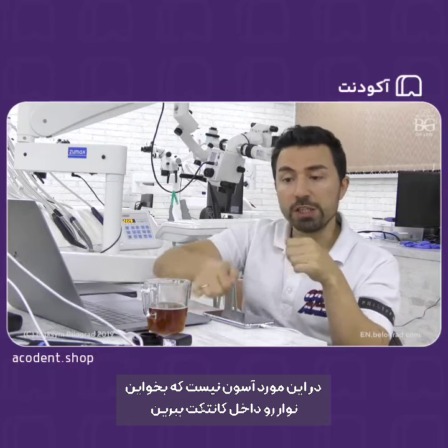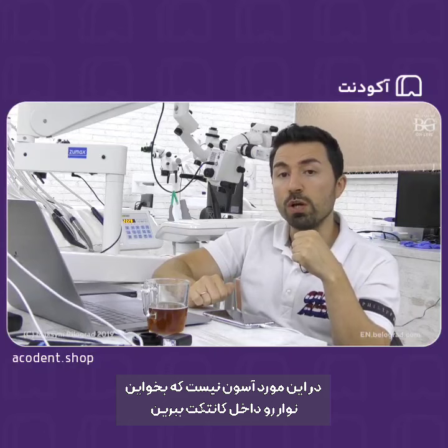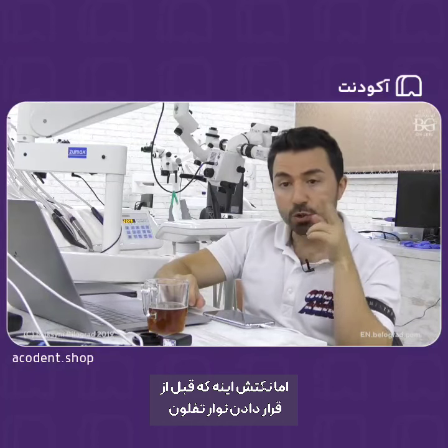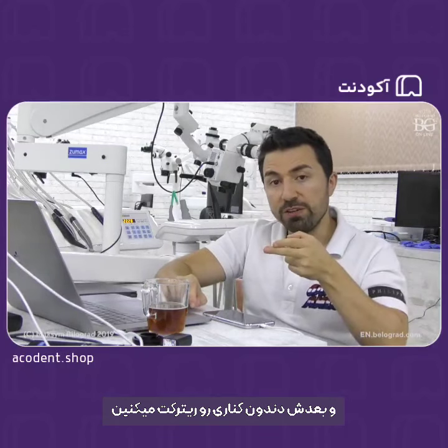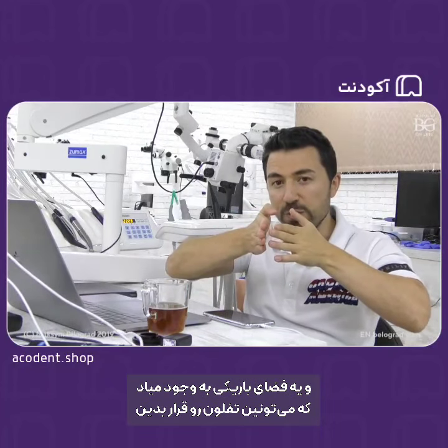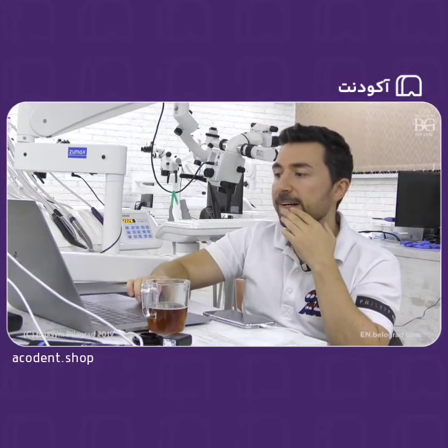In this case, it's not easy to pass through interproximal contacts with Teflon tape, but the trick is, before placing the Teflon, you take a spatula or a flat plastic instrument between the teeth, then you just retract, detach the adjacent teeth, so you may get some small space between, and then you put the Teflon between, and that's it.